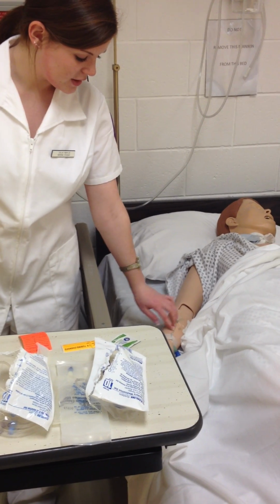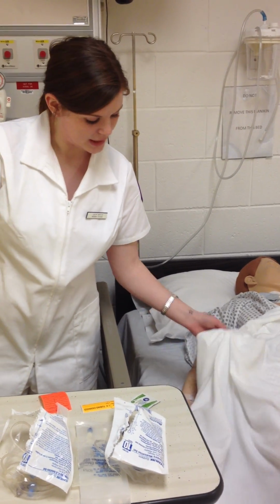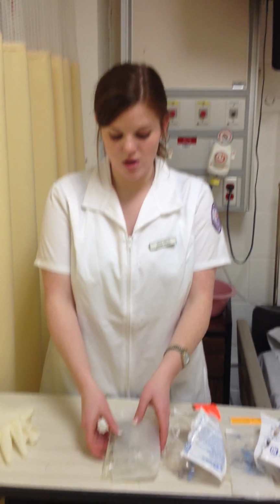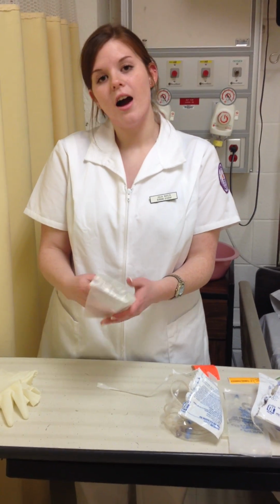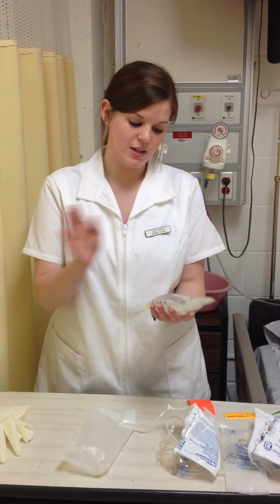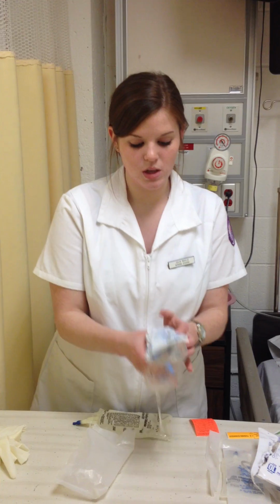I'm going to assess the IV site for any redness, swelling, or patency. And then I'm going to go back to the med room and prepare the IV. The first thing I'm going to do is get the proper IV solution. I'm going to make sure it's not expired. I'm going to put a timestamp label on it with my name, the date, and the time that it's supposed to start and finish. Then I'm going to get the primary tubing.